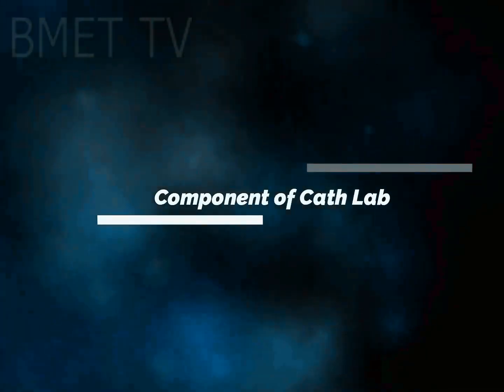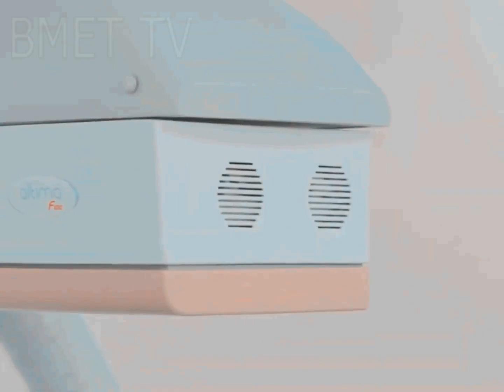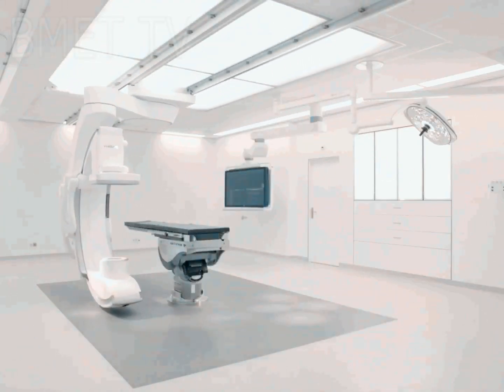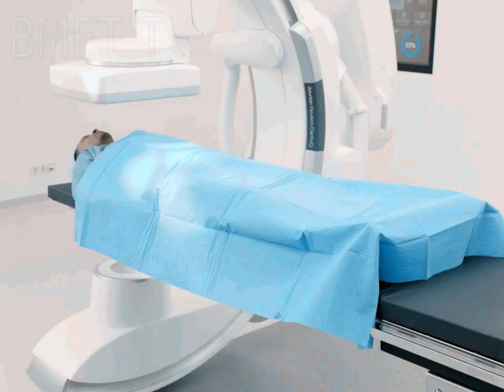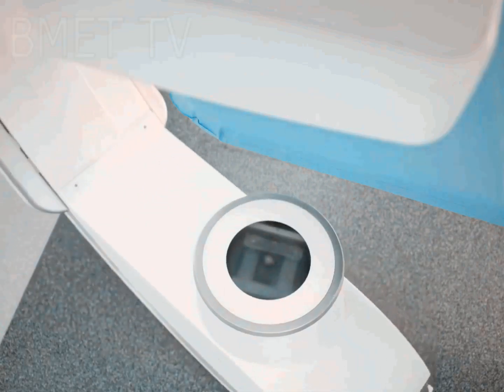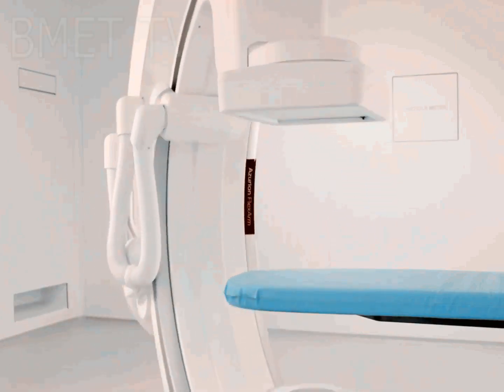Let's know about the components of cath lab. The C-arm, or U-arm, which is the largest and heaviest cath lab part. It is either a floor-mounted or ceiling-suspended arc which carries the X-ray tube and the detector. The X-ray tube is the cath lab part which generates the powerful X-ray pulses in the cinemode. It should be a heavy-duty tube with high heat capacity and improved heat dissipation. A good cooling system is essential.